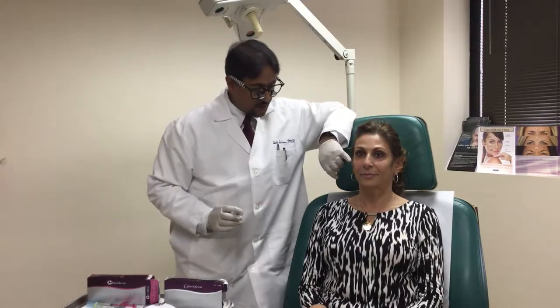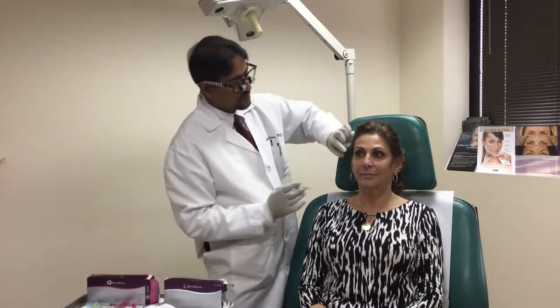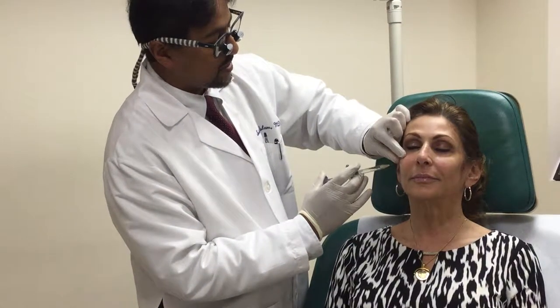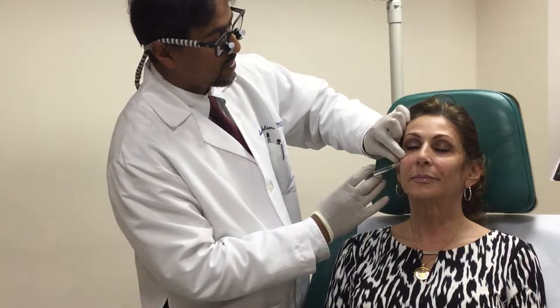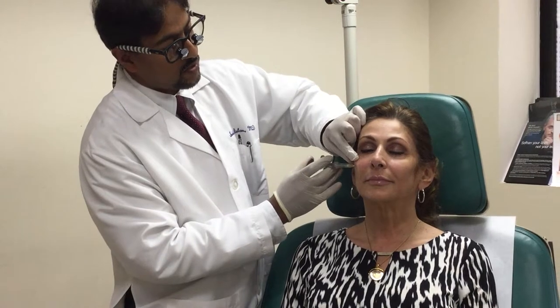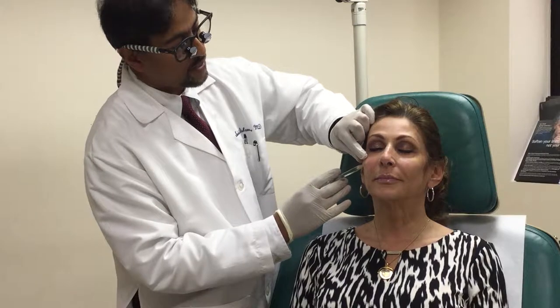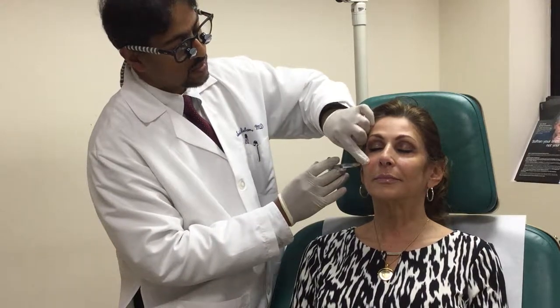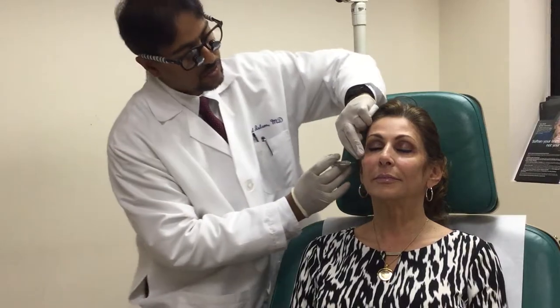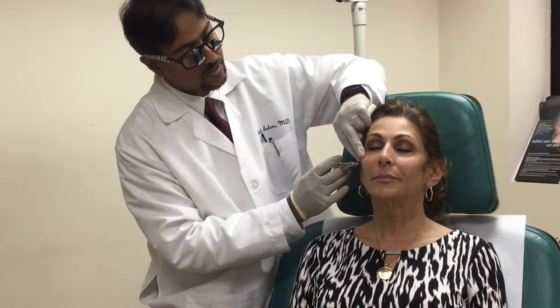Helen's already had some numbing cream on her face to reduce the sensitivity of the skin, and we've cleaned the face with alcohol. The Voluma is really good for the cheeks — as time goes on, most of us lose some fullness in our cheeks. If you look at younger people and children, they have a lot of cheek fullness. We're trying to restore that. You can also give people slightly higher cheekbones and fill in that area as well, which is an added benefit of using these fillers.